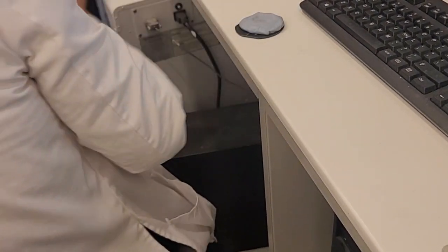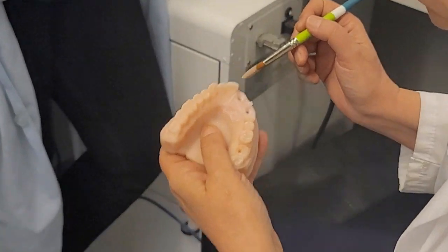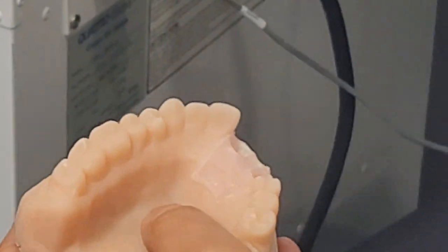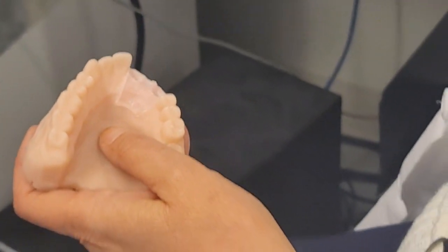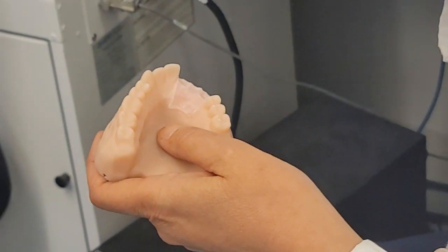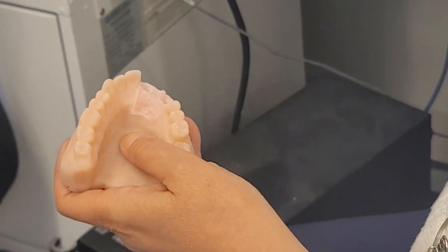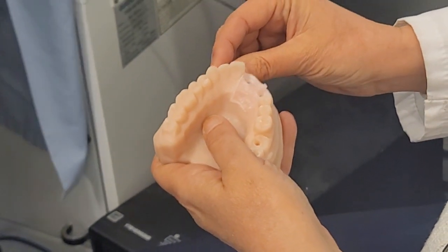I'm going to use a little bit of, this is baby powder. And what I use it for is just to make the area that I want to scan a little dull, not so shiny. Now there are sprays, the companies make different sprays and even powders that you can use. They're kind of expensive. I've been using baby powder for a long time, it works. And then I'm going to insert my scan flags.